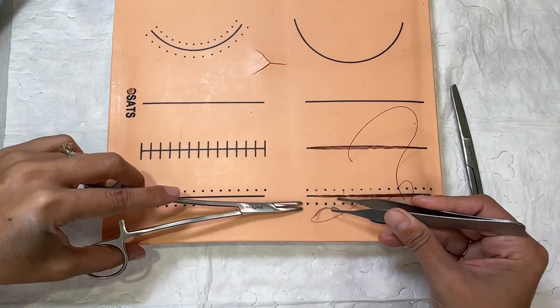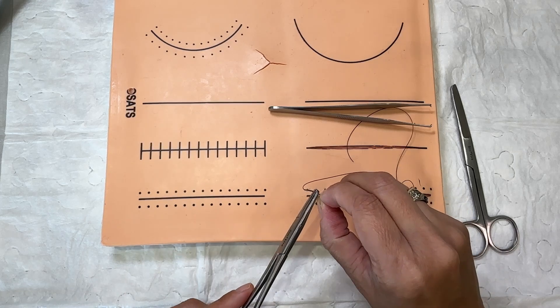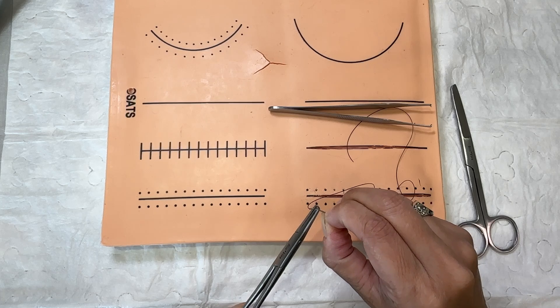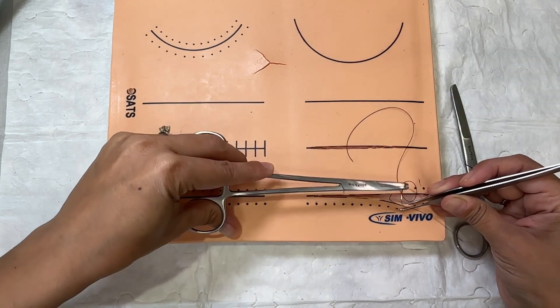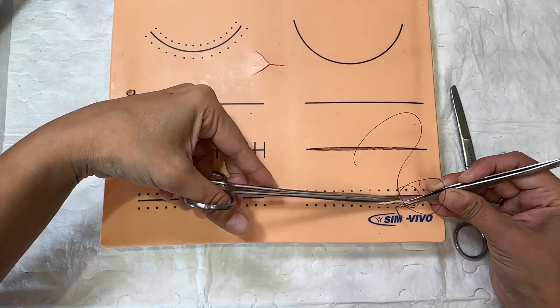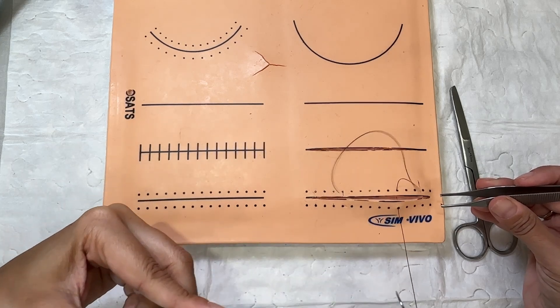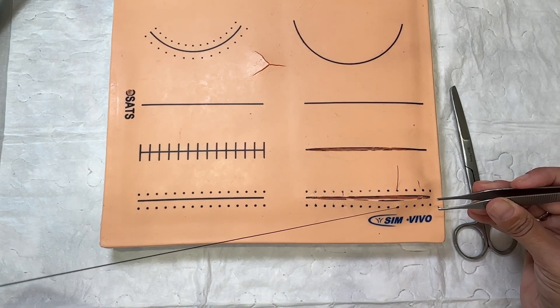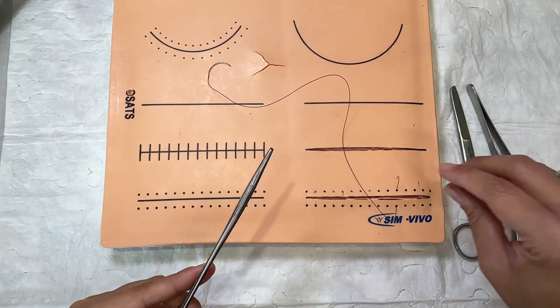Now I'm going to reload my needle as well as I can. Remember, I'm not left-handed, so I'm trying my best. I'm going to load it up again, grab my skin, and come back through this side of the wound. Then disengage the needle driver and pull through. I'm going to get my end right there, lay my needle down, lay my forceps down, and now do my knot tying.